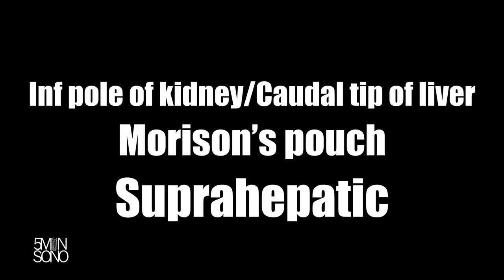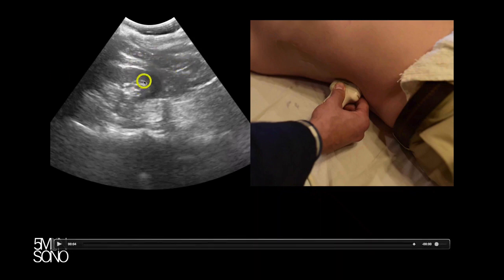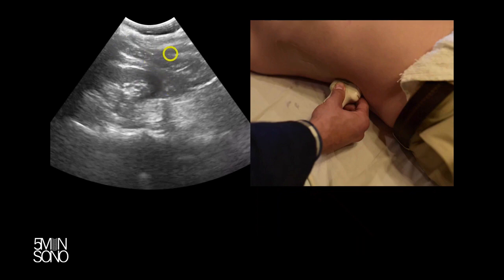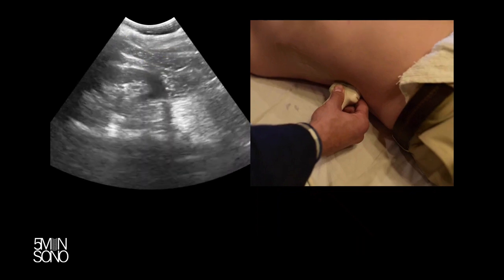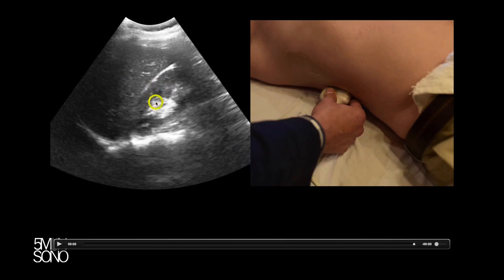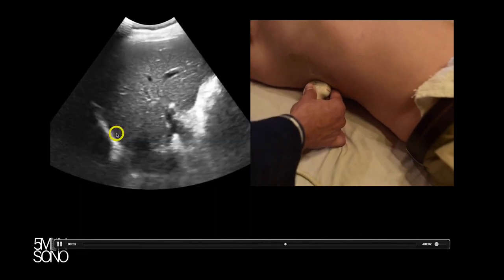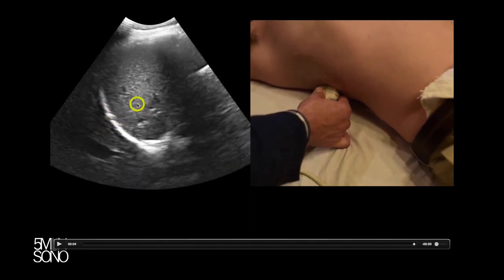With the right upper quadrant, there are three different places you want to evaluate. The most important spot is the inferior pole of the kidney and the caudal tip of the liver interface, followed by Morrison's pouch, and then the suprahepatic area. You want to place the probe right in the mid-axillary line. This is the inferior pole of the kidney, and this is the caudal tip of the liver — this area is where fluid is most likely to accumulate first. The next most common place is the traditional Morrison's pouch view, between the liver and the kidney.